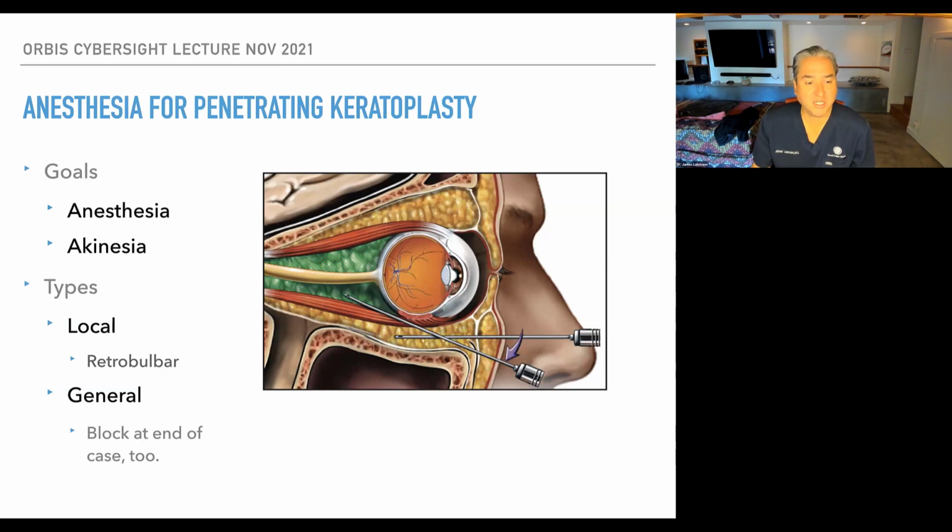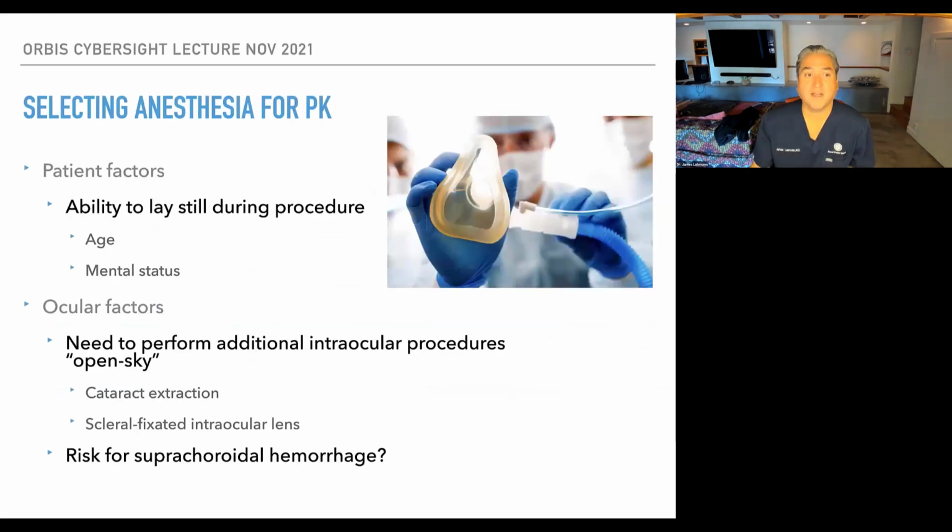Back to the anesthesia. Again, I generally use local, but there's not a problem using general if you want to use that. Actually, in most countries I visited and done PKs, the cases are done under general anesthetic. So again, you want the patient to be able to cooperate during the procedure.